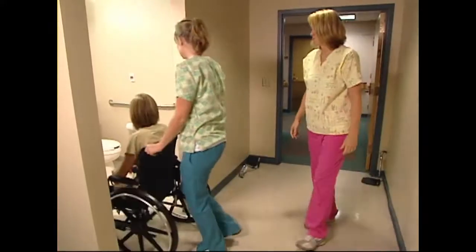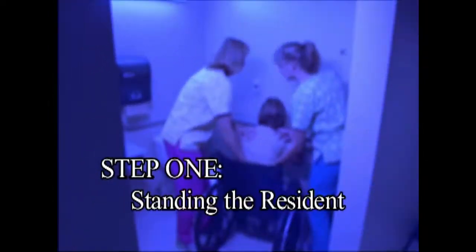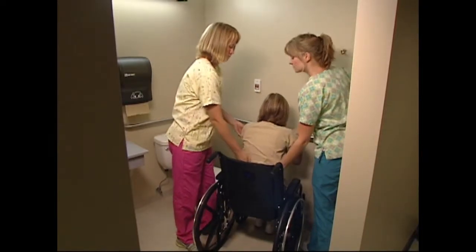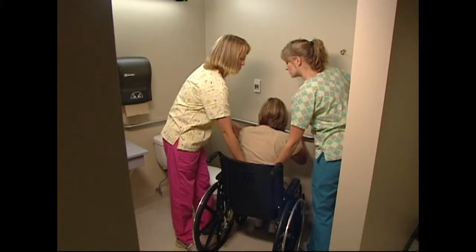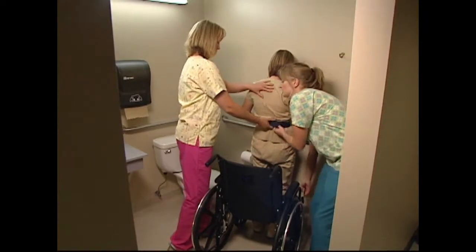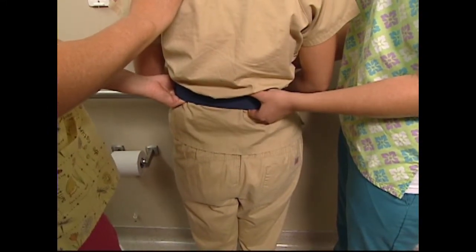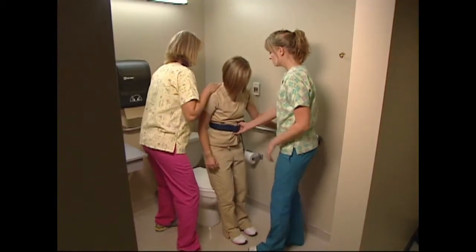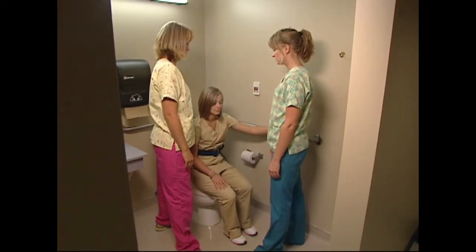Remove the leg rest and wheel the resident into the restroom. Position the chair close to the toilet facing the grab bars. Lock the wheelchair brakes. The first step is to get the resident standing and secure on the grab bar. Ask the resident to scoot to the edge of the wheelchair and lean forward to grab the bars. With your hand on the gate transfer belt, ask the resident to stand on the count of one, two, and three, while you lift and steady the resident on the grab bars. You can then unlock the wheels and roll the wheelchair out of your way. The second step is to pivot the resident, lower their clothing, and set them on the toilet. One caregiver can assist and steady the resident while the other moves the wheelchair. A two-step process allows for a safer, less crowded work environment.